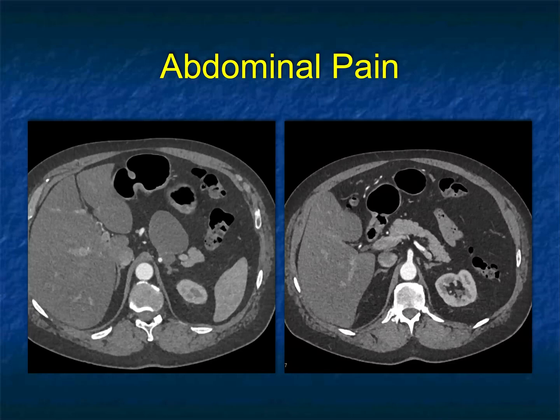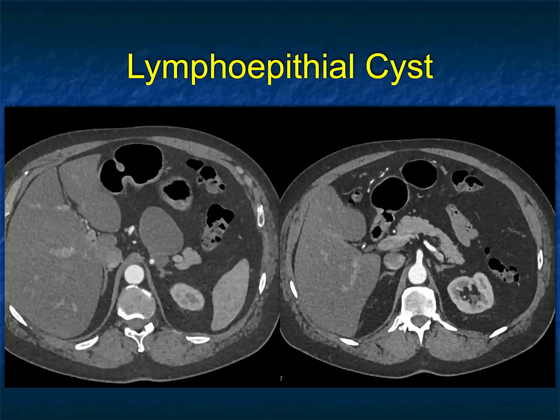What about this case? There's a cystic lesion appearing near and coming off the pancreas. If it weren't from the pancreas you might say lymphangioma, seroma, or cystic hygroma. But it's arising from and touching the pancreas when you look at all images. The classic pancreatic lesion that's cystic, exophytic, barely seems to touch the pancreas, and can be large is a lymphoepithelial cyst. In this case that's the answer. You could think lymphangioma, hemangioma, or pseudocyst, but looking at all coronal and sagittal images it came off the pancreas — a lymphoepithelial cyst, which is a benign lesion.